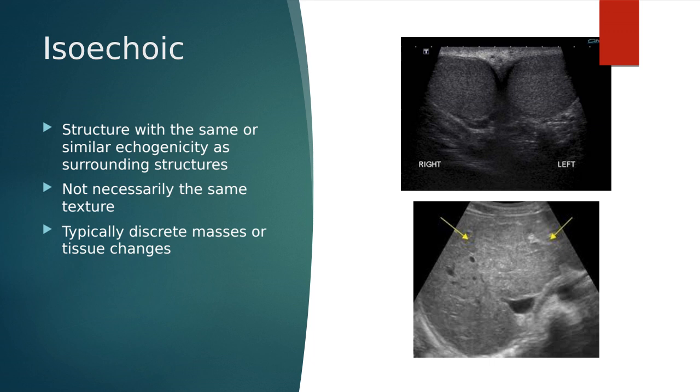And this is actually a liver mass that is isoechoic to the surrounding liver tissue. So that's really hard for us to see when we're scanning, and that's where your precision has to come in. This is where we really start to train our eye to pick up on these subtle discrete findings, and we're looking at every piece of tissue in every structure, and we're really investigating it. And we're trying to say, are you the problem or are you normal?